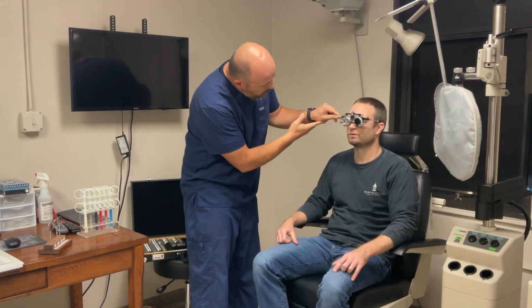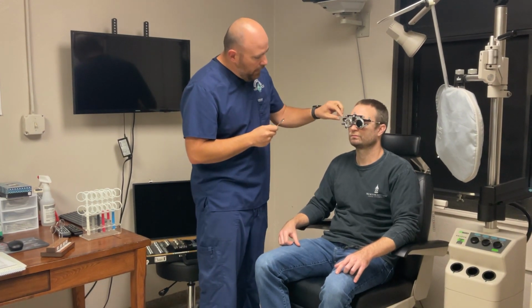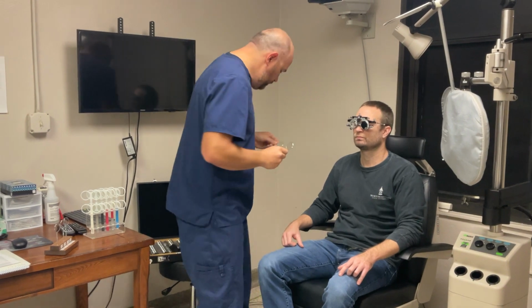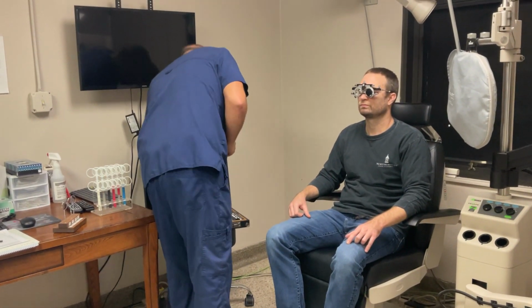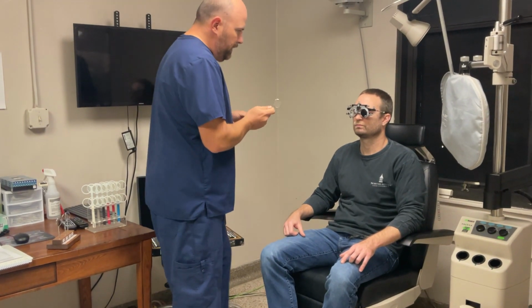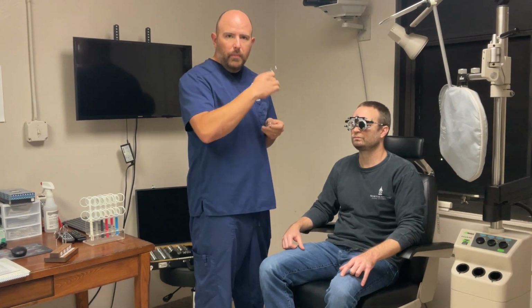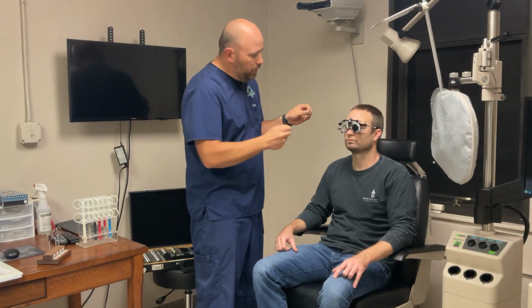1 or 2? 2. 2, all right, so the patient is wanting more plus in this case. He's got a minus 2 in there, and so I'm going to remove that, and instead I'm going to grab a minus 125. Because we're using a plus or minus 75 JCC lens, a minus 2 is in there, he wanted the plus side, and so I'm going to select a minus 125 in this case.